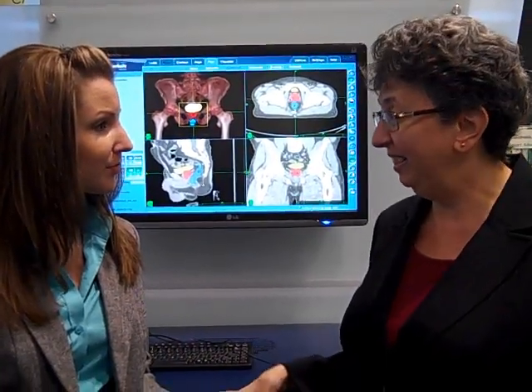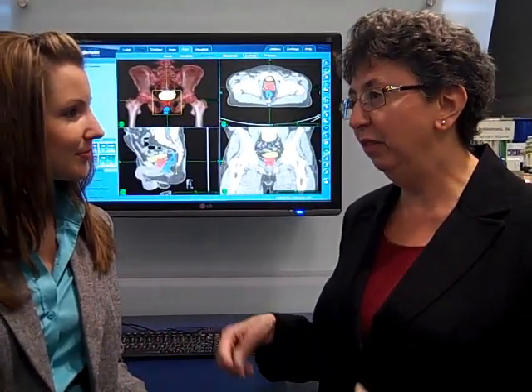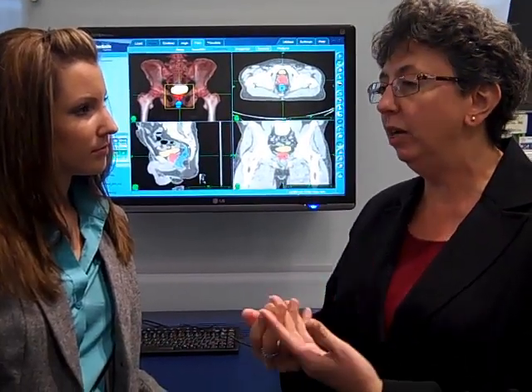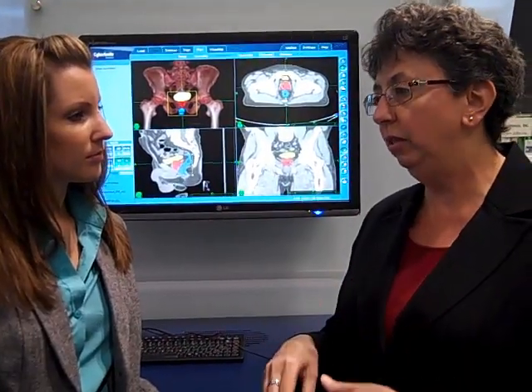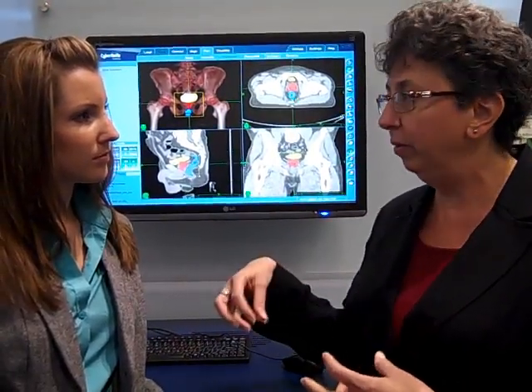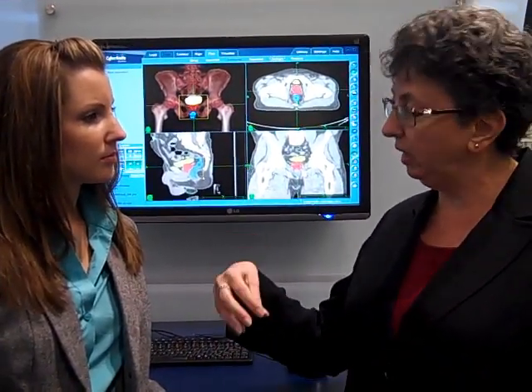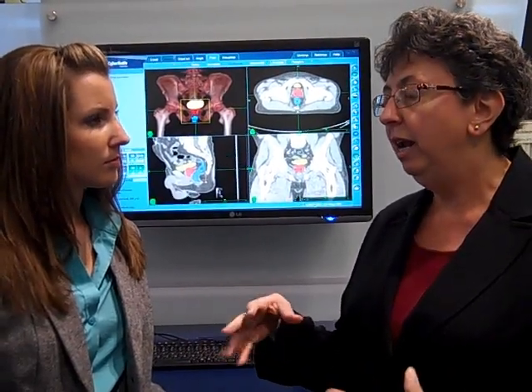Absolutely, I'd be glad to walk you through the treatment plan. The first thing to really understand is what exactly is a treatment plan. The treatment plan itself is the recipe — it's the instructions to the system for how to deliver the treatment to the patient. The instructions include things like where the robot moves in space and where it stops to deliver beams to the patient.